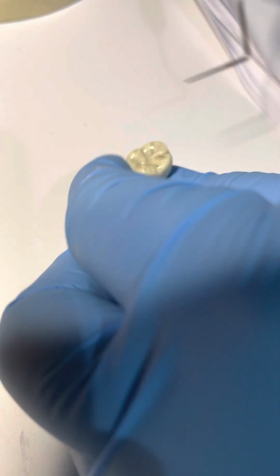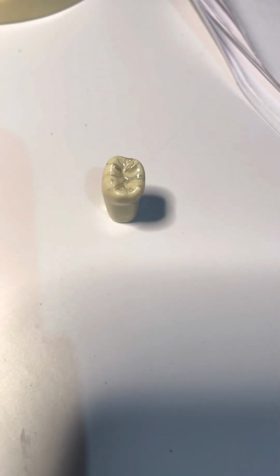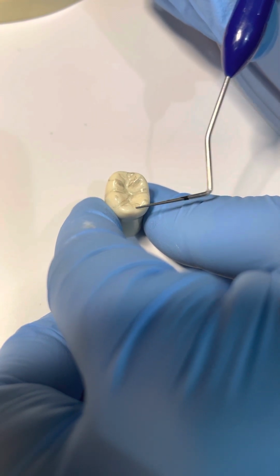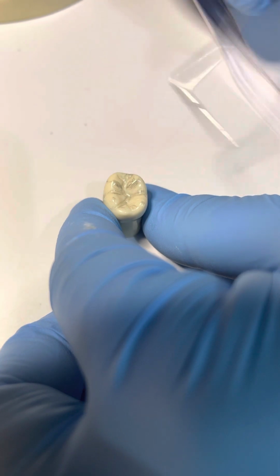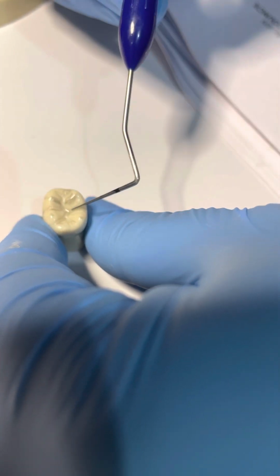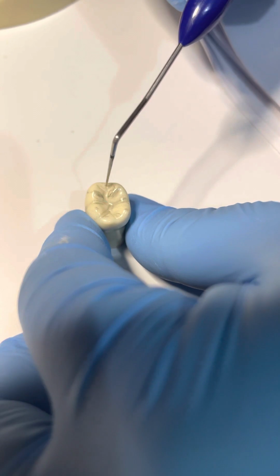So this is our lower molar anatomy. And then we talk about the M and Y. When you are carving lingually, you have to do the M. So come from distal, that's your M. Then first you do your M, carve from this and then this, and then you create the negative space and then your positive space.